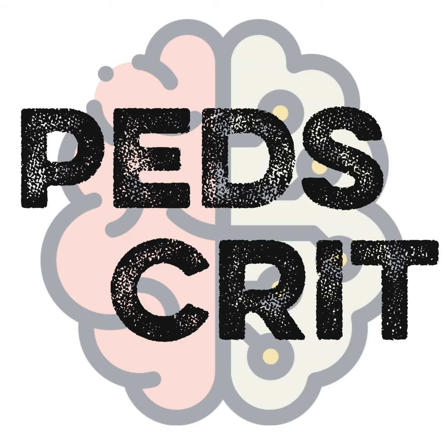I would say, though, in our central cannulation patients, post-cardiac surgery population, because it's an open sternum and it's a central cannulation, all of them get a LA vent, which is a decompression strategy.